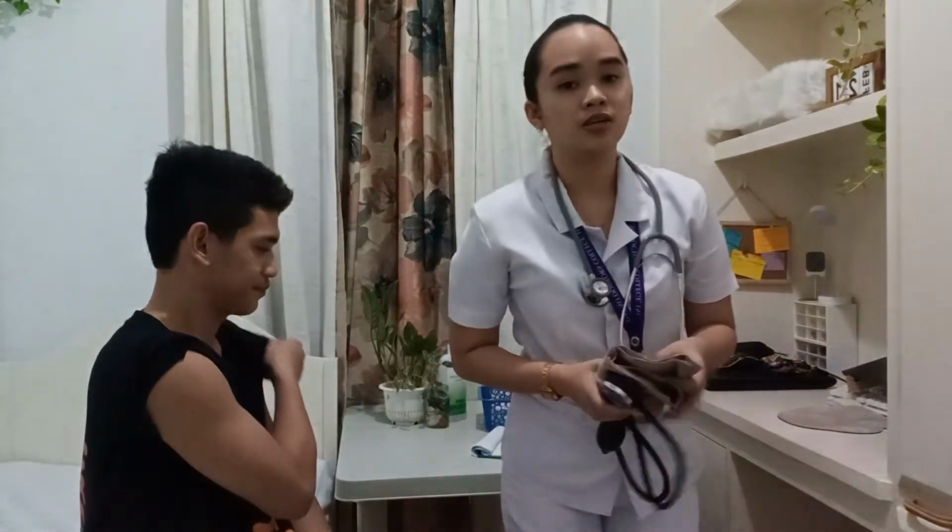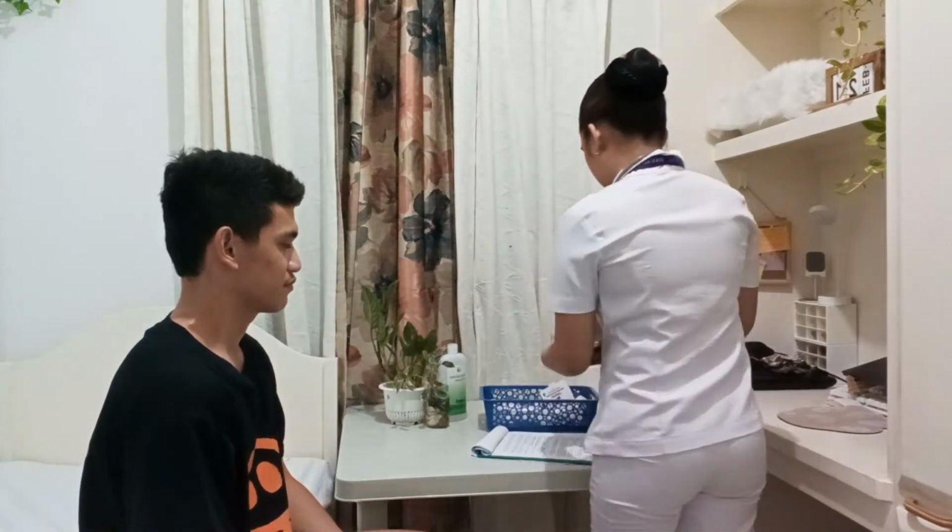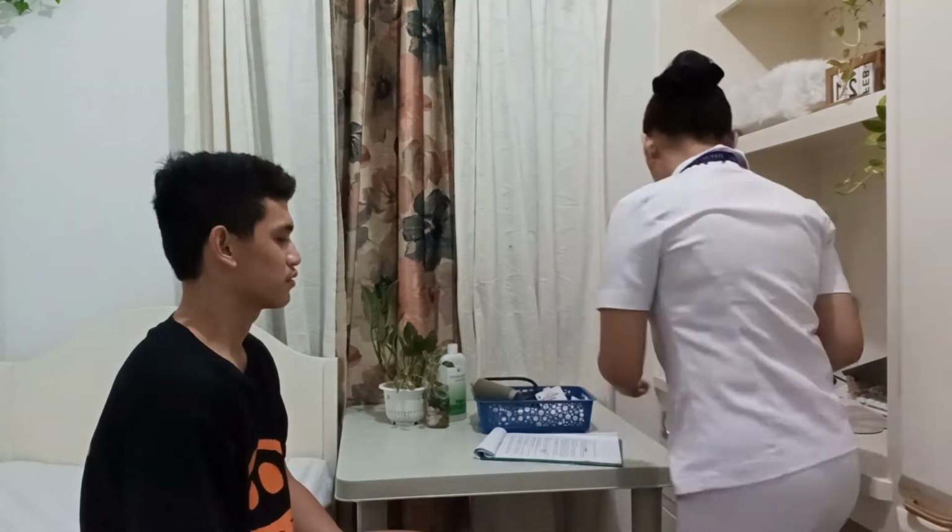Now that I'm done assessing the blood pressure of my patient, I'm going to disinfect the sphygmomanometer and also my stethoscope to avoid cross-contamination. Now that I'm done disinfecting, I'm going to do hand washing, and also I'm going to record or document the blood pressure of my patient in his monitoring sheet.